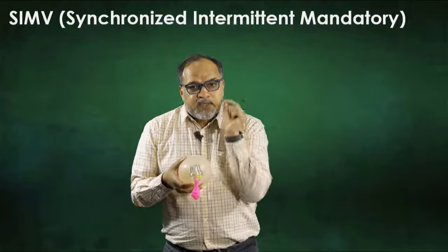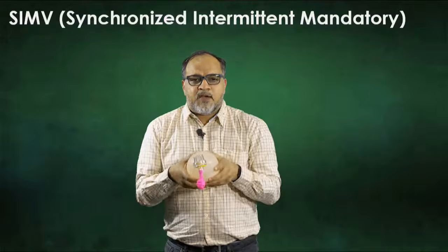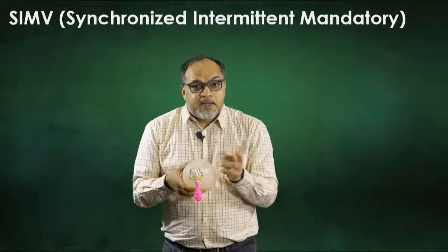But if the patient triggers in between, the ventilator will keep quiet. So the ventilator will keep giving the triggered breaths and the mandatory breaths, and by any chance, if the patient triggers at the time of the expected mandatory breath, then the ventilator will turn that triggered breath into a mandatory one. Didn't get it? I'll explain. 1, 2, 3, 4, 5, 5.5, patient triggered. So the ventilator will convert that triggered breath into a 500 ml tidal volume breath. Getting it?